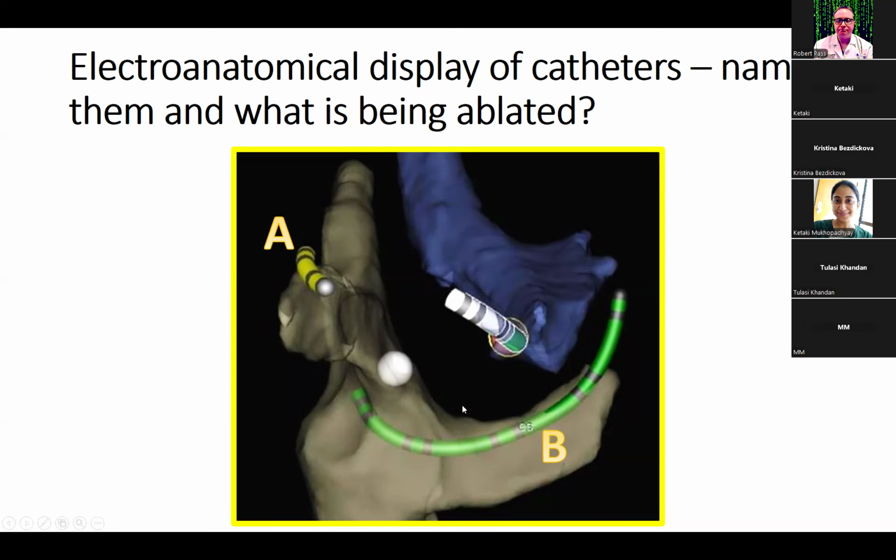Now, that might seem like a lot of turns and complicated catheter manipulation, but actually amongst people who do that routinely, they'll tell you it's very easy, very straightforward, very quick. And they actually think that doing a transeptal is dangerous. And they'll tell you that, and people have done studies assessing whether a transeptal or a retrograde approach to pathways is more effective. And it turns out that they're roughly the same.